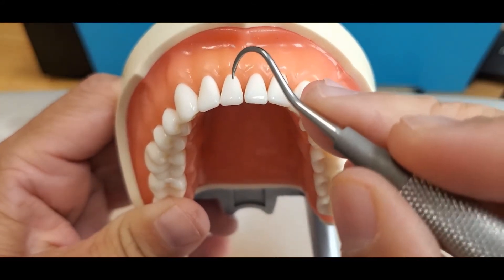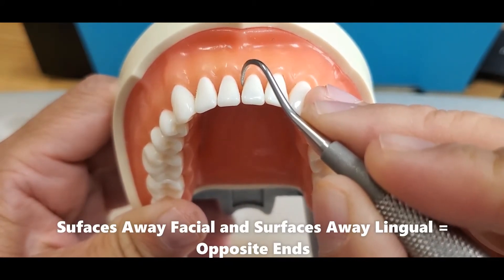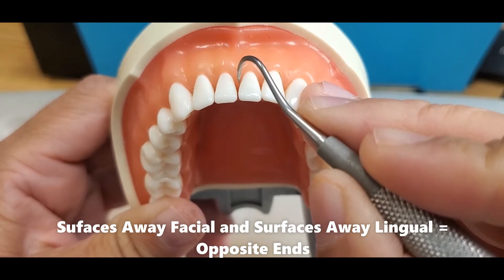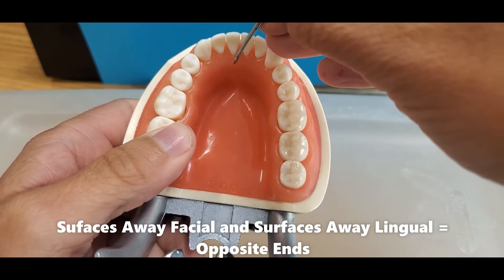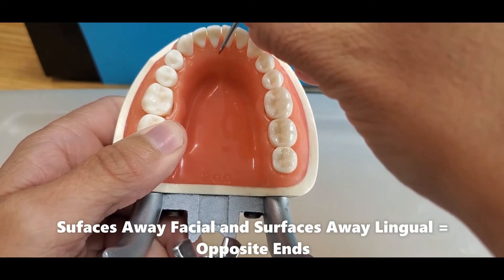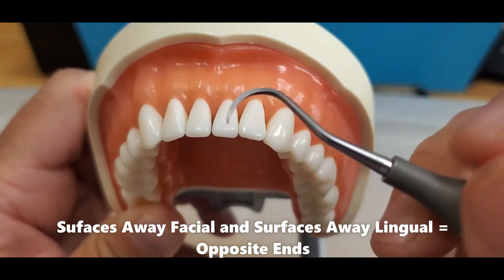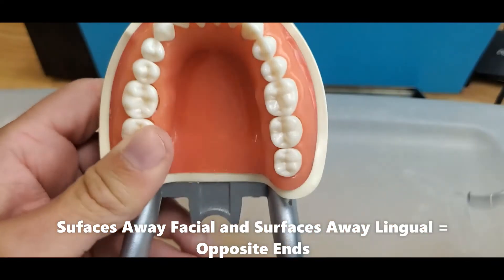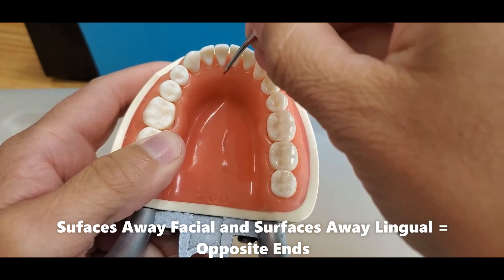When switching to the lingual surfaces, remember that you always need to switch ends for the same tooth, same towards or away — in this case, away surface on the lingual. It will be difficult to see which working end is correct on the lingual. So the recommendation is to find the correct working end on the facial, stay in the same clock position on the away surface, and flip ends for the lingual.